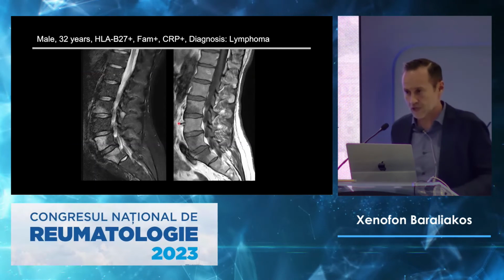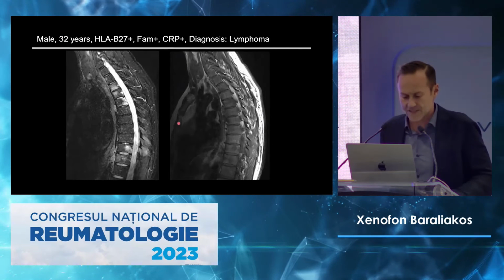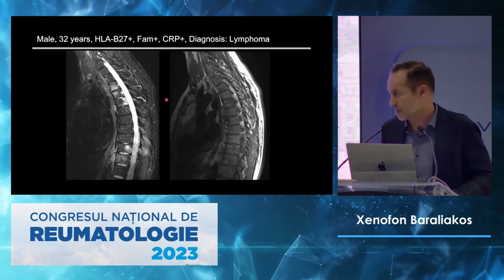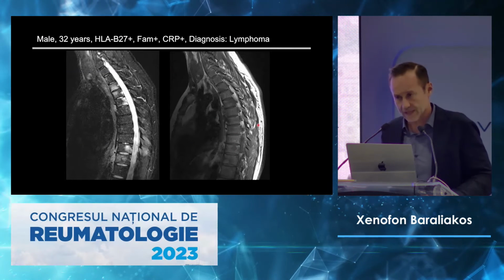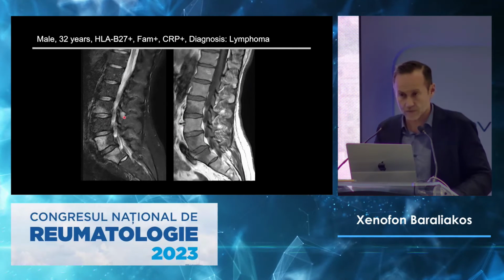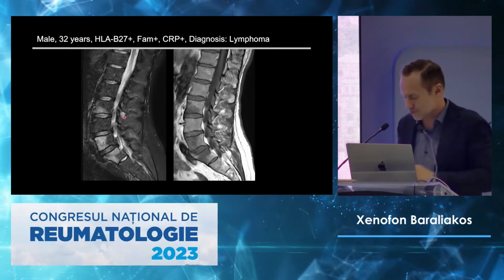And that patient obviously didn't have many symptoms. If you go and examine the same patient, you see how much inflammation there is in the spine. Yeah? And you see here those darker areas. In any case, what I want to say is that symptoms are important, imaging is important, but sometimes we just cannot get it right, unfortunately.